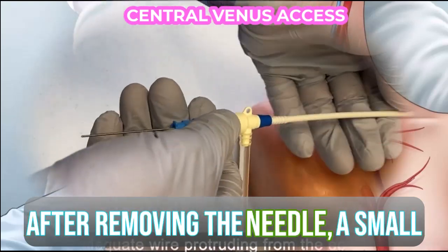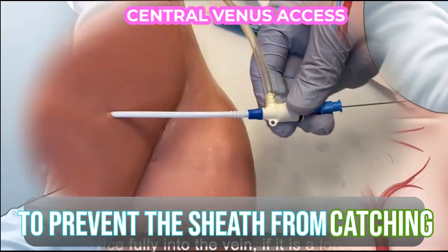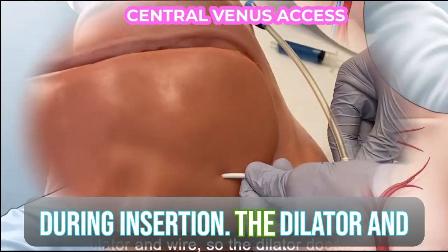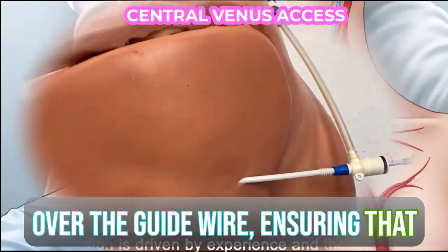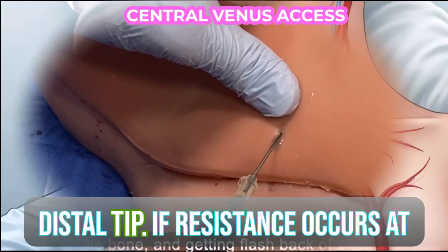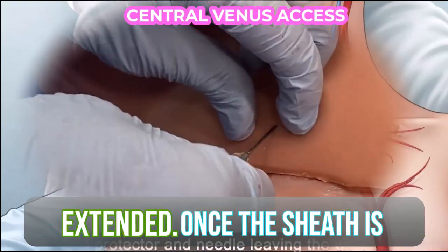After removing the needle, a small skin incision is made beside the wire to prevent the sheath from catching during insertion. The dilator and sheath are then passed together over the guide wire, ensuring that the wire protrudes beyond the distal tip. If resistance occurs at the skin level, the incision should be extended.